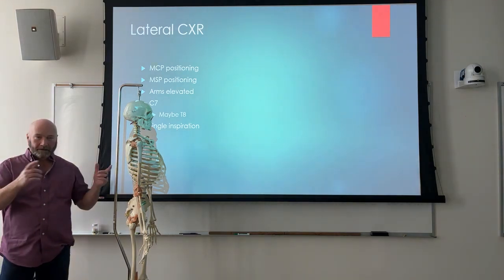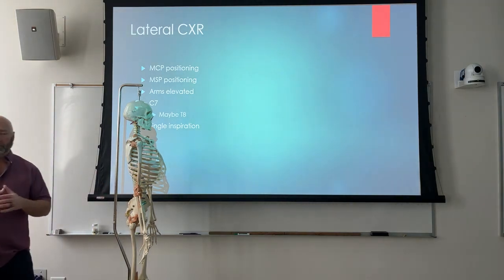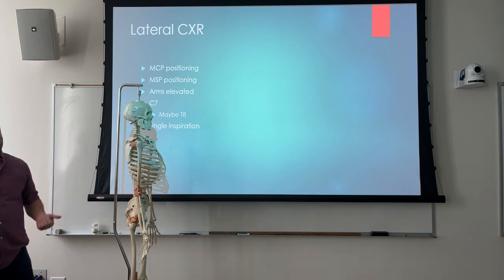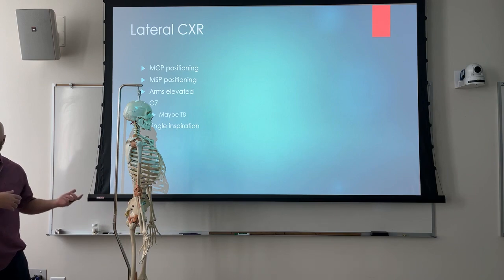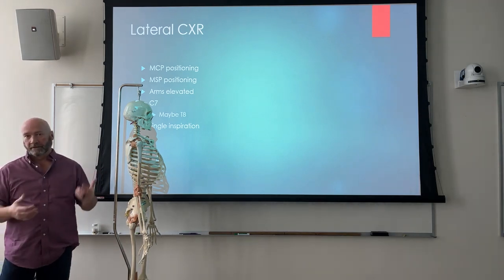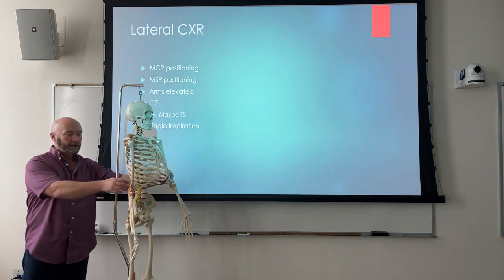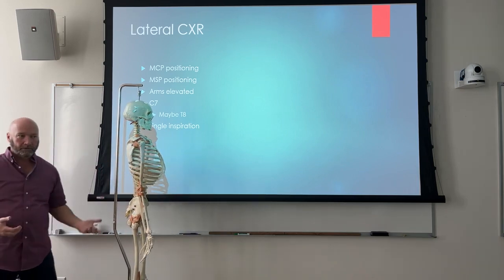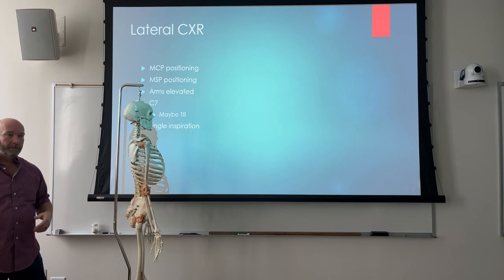One is, let's put the brakes on for just a second, but if you've got a joint that you don't use, eventually it's going to get stiff, right? So this lady could not lift her arm, so she had disuse in that shoulder. She had about this much mobility. So on a lateral chest X-ray, just let her let it hang. Is that going to be a problem?